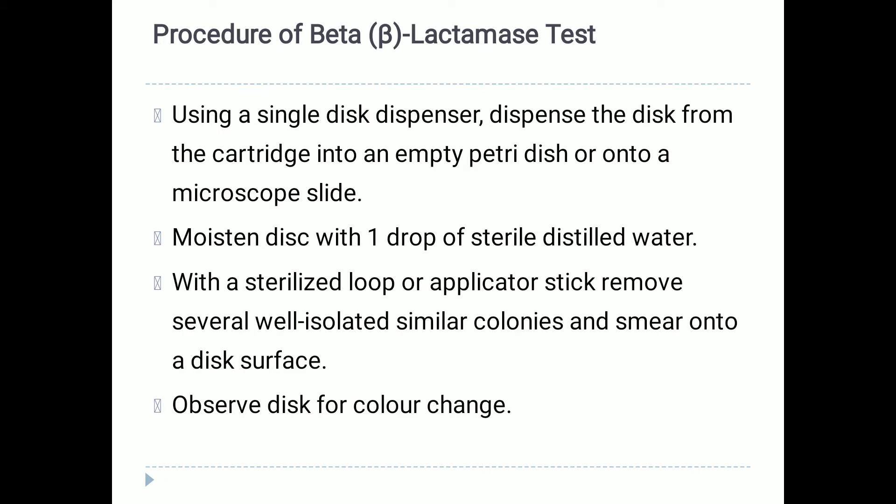For the procedure, first we use a single disc dispenser to dispense the disc from a cartridge into an empty petri dish or onto a microscopic slide. Then we moisten the disc with one drop of sterile distilled water. Using a sterile loop or applicator stick, we remove several well-isolated similar colonies and smear them onto the disc surface.